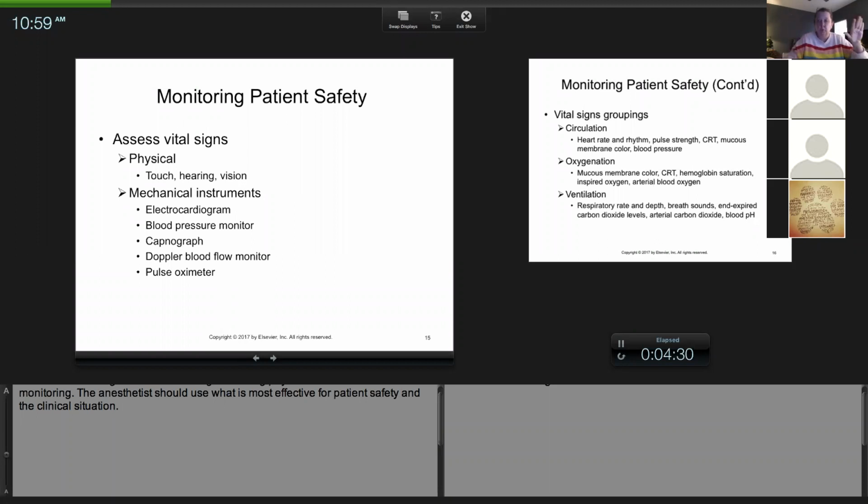And I said, don't look at that. Put your stethoscope in your ears. And when she listened, the heart was just very regular. And she's like, it's not even doing that. I'm like, but watch what's happening. You have someone scrubbing, so the leads are shaking, and therefore your ECG is all over the place. Monitors are useful, but I said, I don't want you looking at the ECG and taking your heart rate from that. I want you listening to the heart actually beating. That's going to be more accurate. That's the heart rate. So with mechanical instruments, you have to know both.